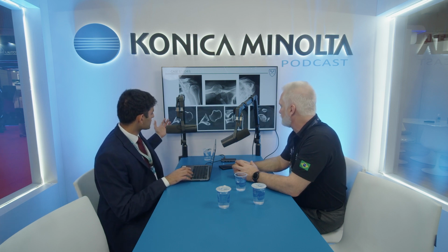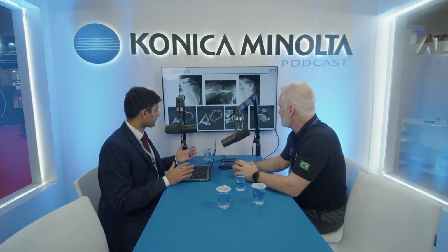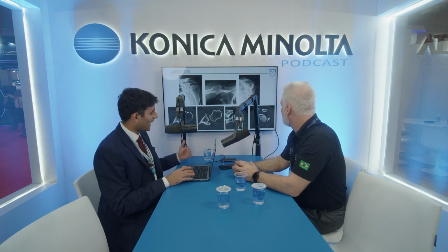you could see that this patient, because they had a seizure disorder, had a pacemaker type device helping them with that seizure disorder. But in the shoulder, from previous shoulder surgery, the patient had had a posterior bone block procedure that was trying to keep the humeral head within the glenoid. But unfortunately, as you can see on the CT, there was a lot of bone resorption. There's previous anchors from rotator cuff repairs and labral repairs trying to hold the shoulder in place.